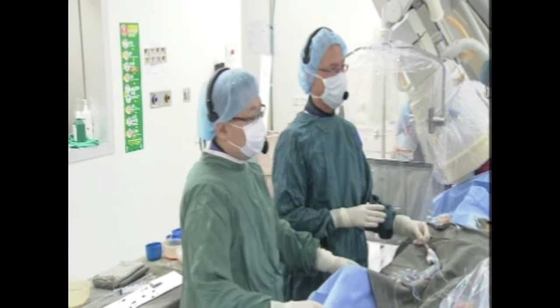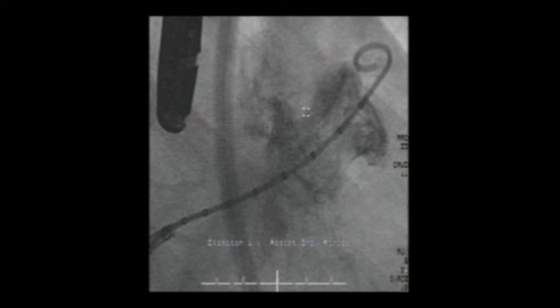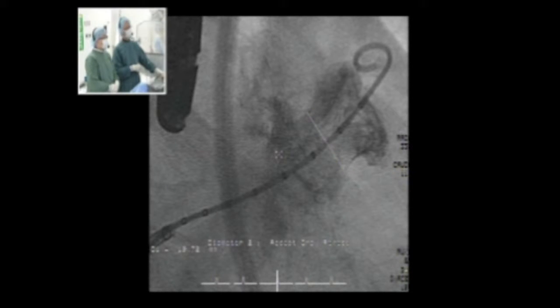So we have already done the transseptal puncture, and you see on the fluoro screen the angiography of the appendage. I was a little bit surprised that I don't see any filling distally, but I learned that this pigtail has more side holes proximally, so that's probably the explanation. They have just calibrated, and in this diameter it's only 19.7, let's say 20. So that's the only thing we have done so far. It's a right anterior oblique caudal projection. Now let's move on to the echo.